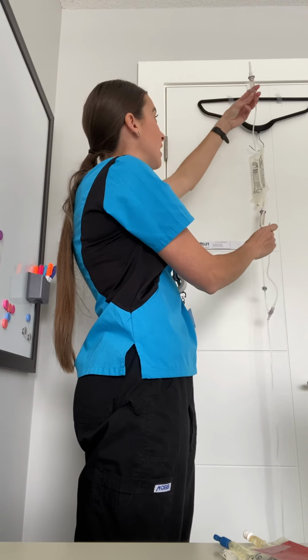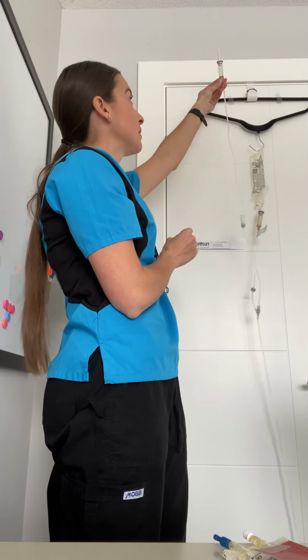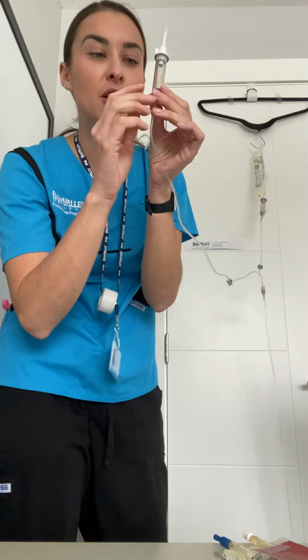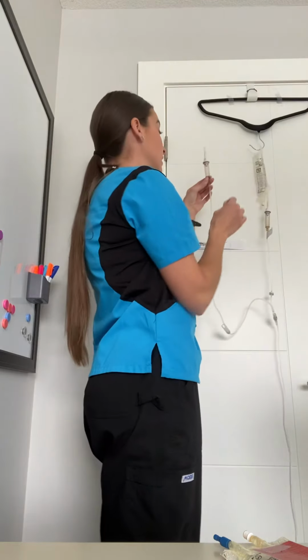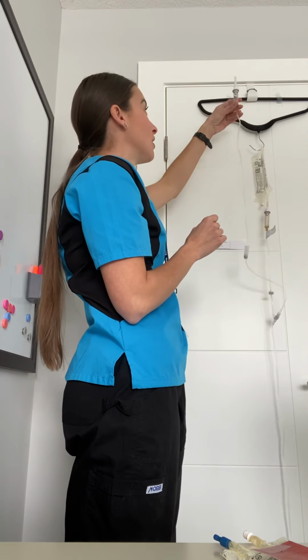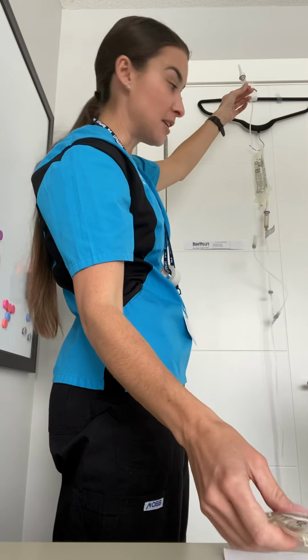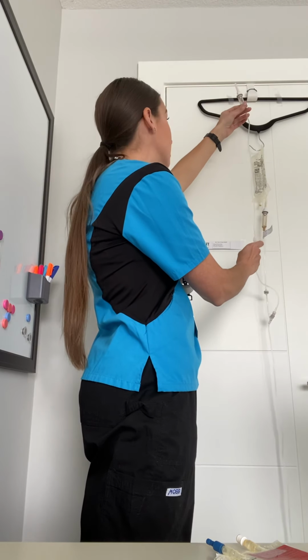My bag is really low here, but what we want is to have the drip chamber about 1/3 full, okay? As you can see, I kind of drained this bag by accident, so we want to make sure. Once we have it 1/3 full, we can then do the IV piggyback, okay? And so we'll roll this closed.